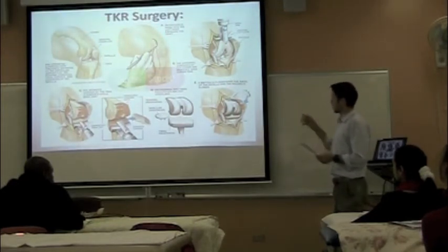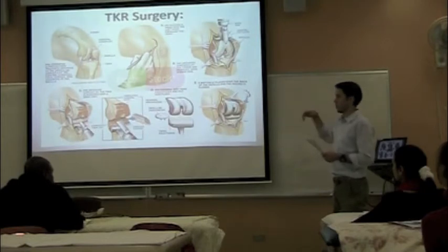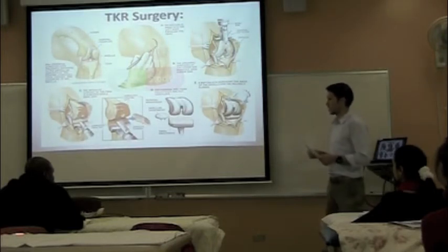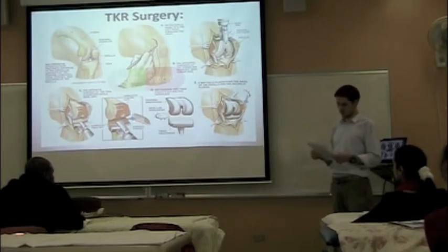Okay. So once range of motion is checked, it's then all stitched up, and then the patient is taken to another room where they can check his vital signs and vital organs from a traumatic invasive surgery of this nature. And then in his room, that'll also be checked, and he'll remain in the hospital for 3 to 4 days.